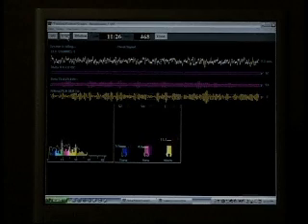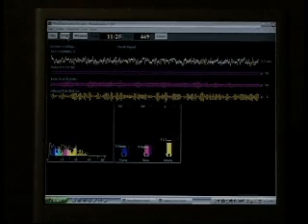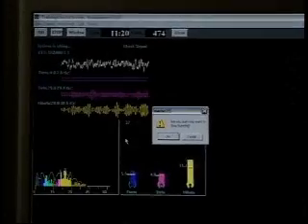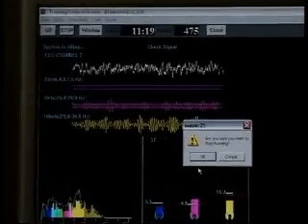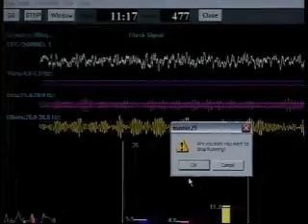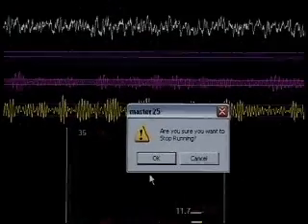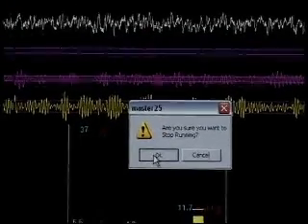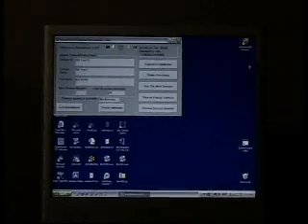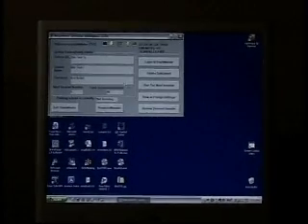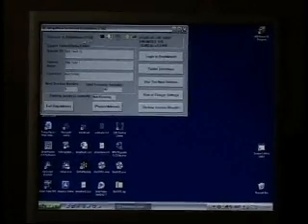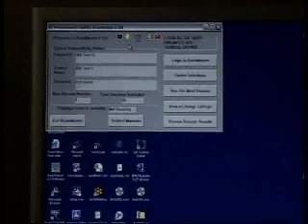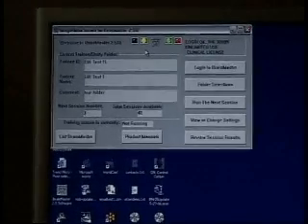We're going to go ahead and stop this training session here. We simply hit stop. You'll notice a dialog box that asks you, are you sure you want to stop running? I hit okay. Then we can simply close the training screen, and it takes us back to our setup home screen for Brain Master 2.5 SE.